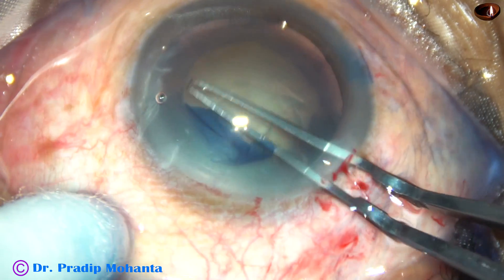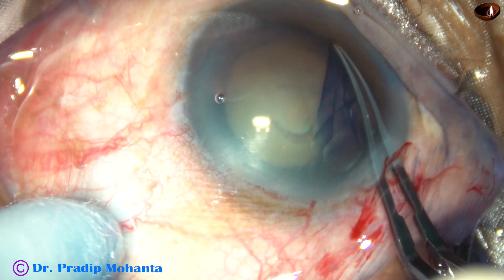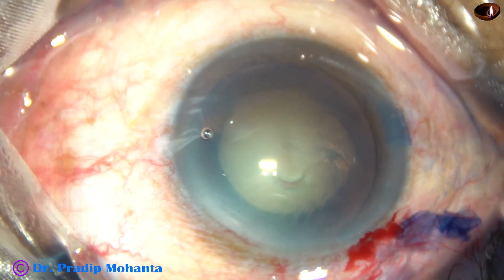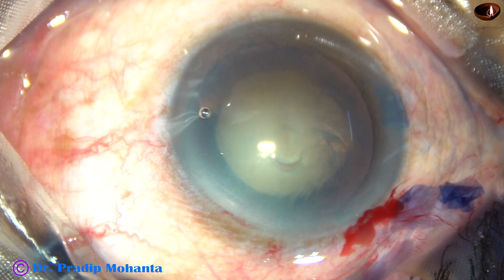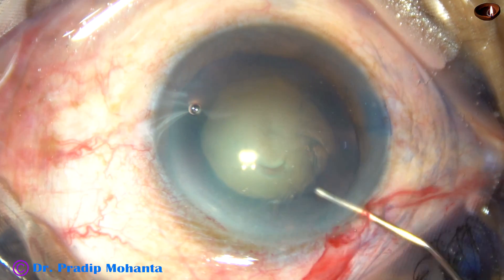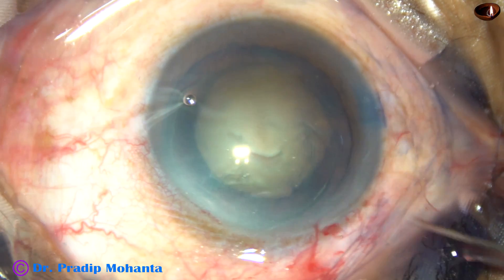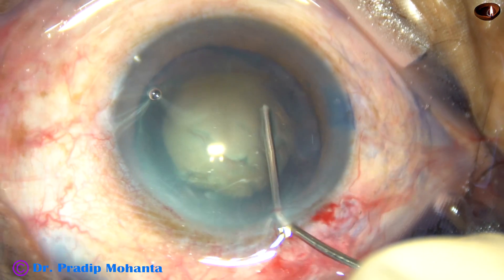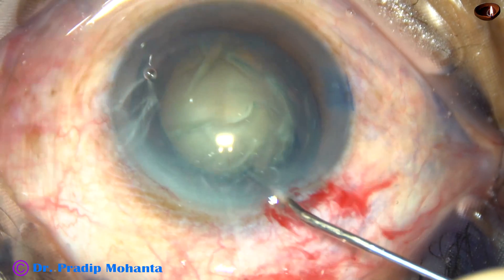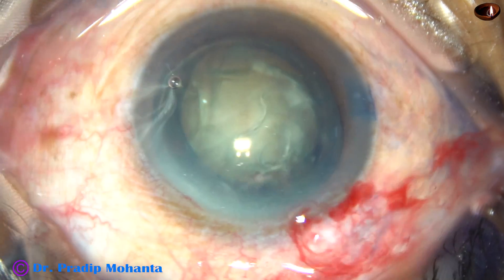This is the basic technique and you get to know your machine very well through this technique. This is very safe, and the only thing is you have to go to a deeper level to divide the nucleus into fragments. If your trench is superficial, it is not going to divide. The depth of the trench should be at least two-thirds of the thickness of the lens — not half, at least two-thirds.